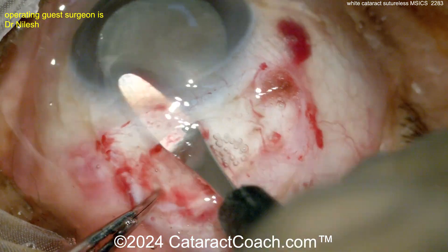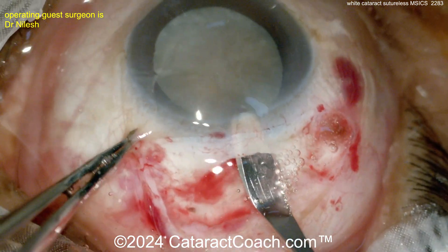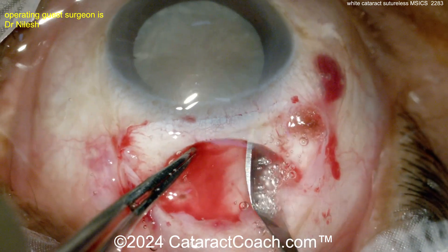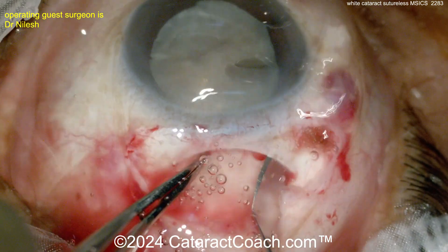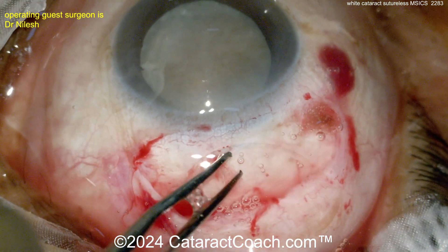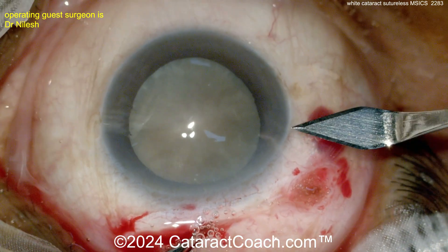The tunnel length will be about three millimeters. Look how evenly the cornea is being split in the periphery into lamellae — this is that half scleral depth and half peripheral corneal depth incision. It has a very distinct funnel or trapezoid shape.